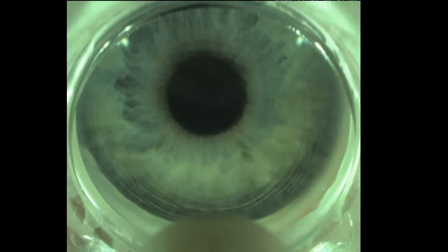This is a video of my technique of SmartSight keyhole laser vision correction with the Schwind Atos laser.